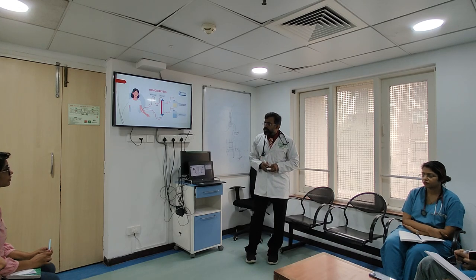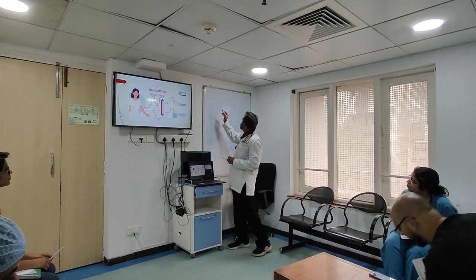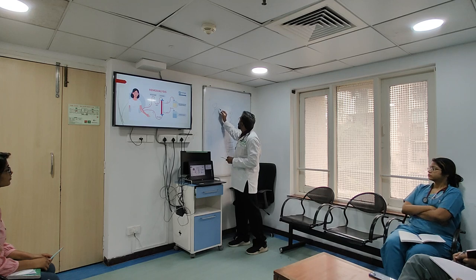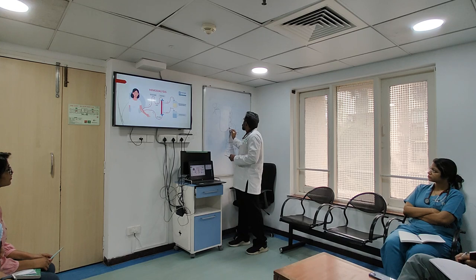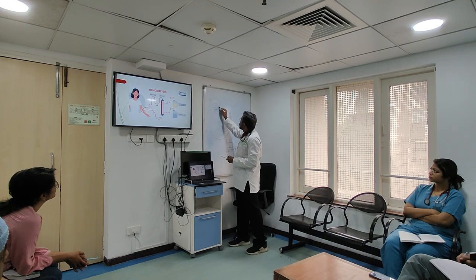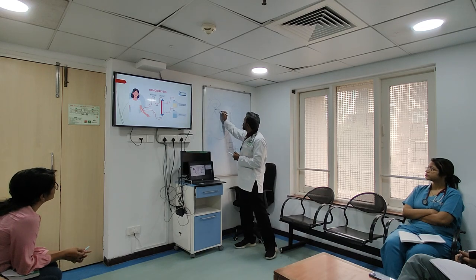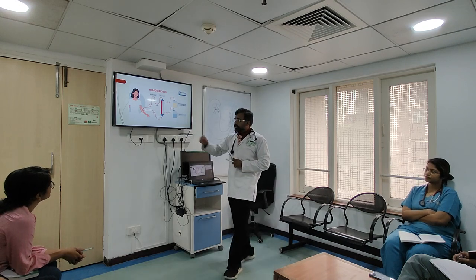Understood? Diffusion? So if I put a patient on this now, I'll put one patient here, and I put an access over here. My access goes from here, goes into this, and my return fluid comes from here and goes into this. Right? It's reversed. And here I have one pump. This is my pump, the pump that she's talking about. The roller pump.